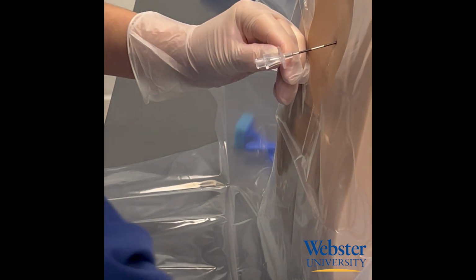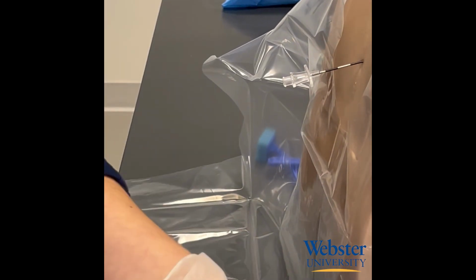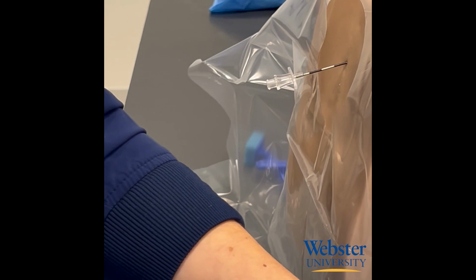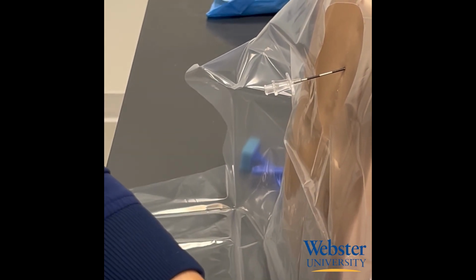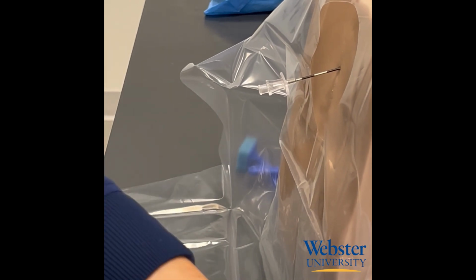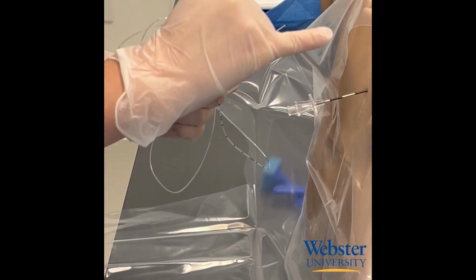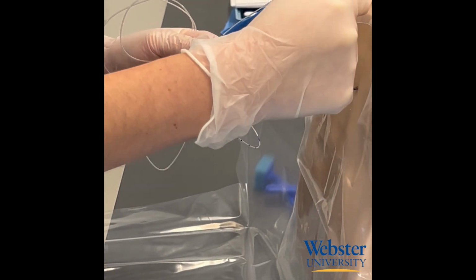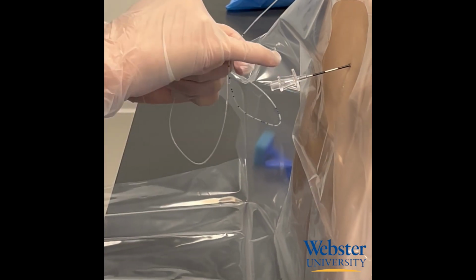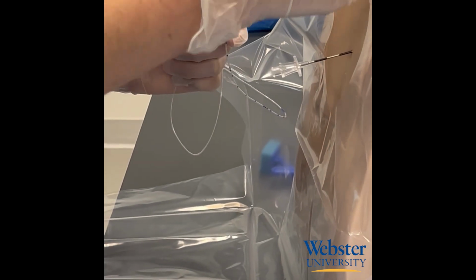Now you want to remove the syringe, make sure there is no cerebrospinal fluid coming out, and then you can start to thread the catheter. You want to note how deep the epidural needle is in the skin to the epidural space. So I have 1, 2, 3, 4, 5 centimeters sticking out, so I know there's 5 centimeters in the skin.